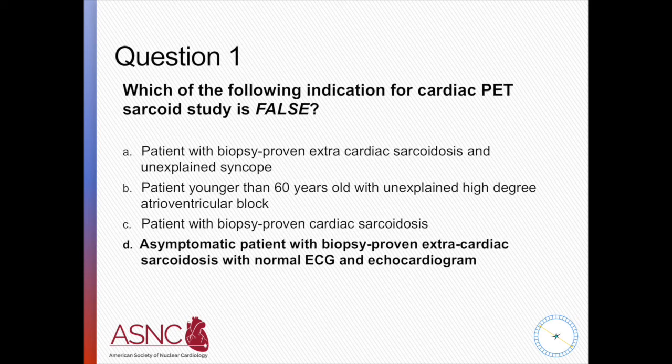I think in those patients, what is usually recommended is close follow-up. There will always be the concern for extension and involvement of the heart, even if the initial presentation doesn't have any suggestion of it. But at that point, I wouldn't necessarily jump into cardiac PET. Good. All right, so we go on to the next question.